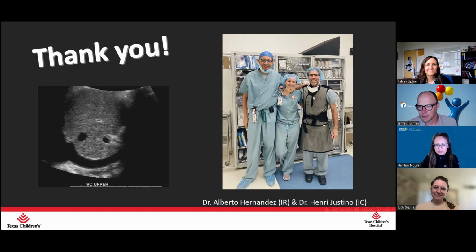And then another question from our chat is, you had mentioned the IQR median to make sure that those numbers are representative of quality for the examination. So it says, does the sonographer keep trying until they get that number within the range, or do you just report the values as is and give the disclaimer that it may not be a quality study?